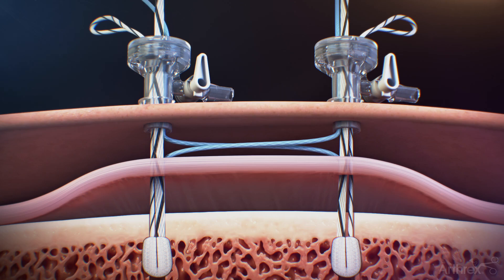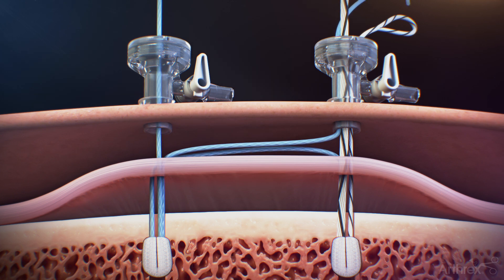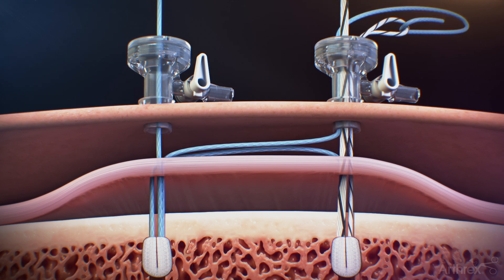Outside the anterior lateral cannula, load the repair suture through the loop of the TigerLink suture. Transfer the repair suture by pulling the suture tape side of the white-black shuttle suture until light resistance is felt.